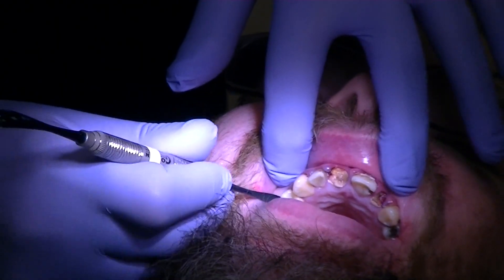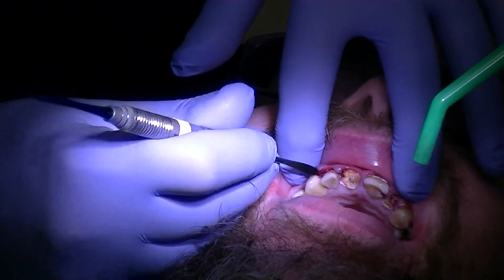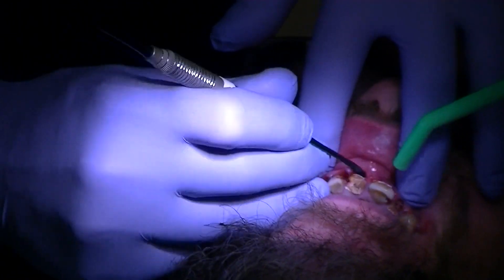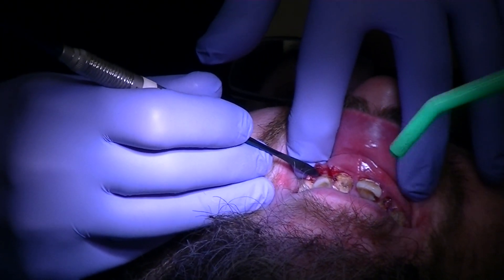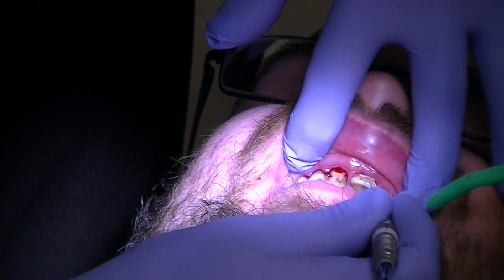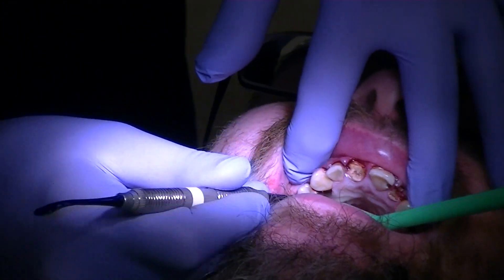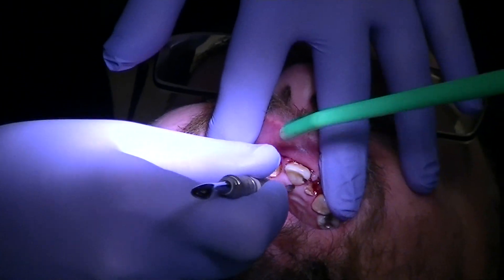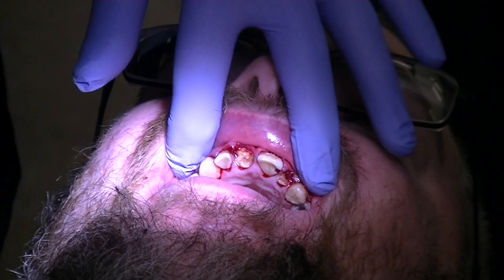The first thing we're going to do is sever the PDL and separate that a little bit. Pressure is normal, pain is not — so if you have any pain you let me know. You can see just really how quickly — my goal is not to reflect it flat, but just by severing the PDL that's happening because the gums are not the healthiest here. We gave infiltration in the buccal vestibule and also an incisive block.